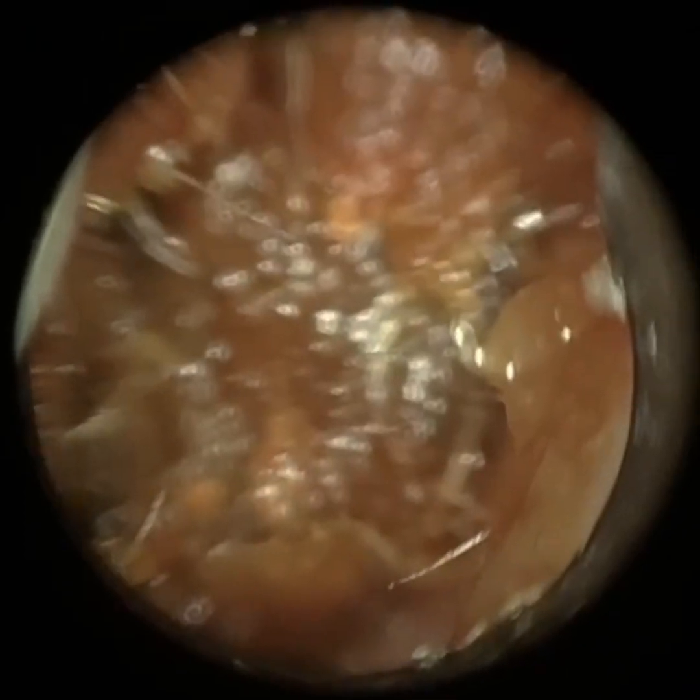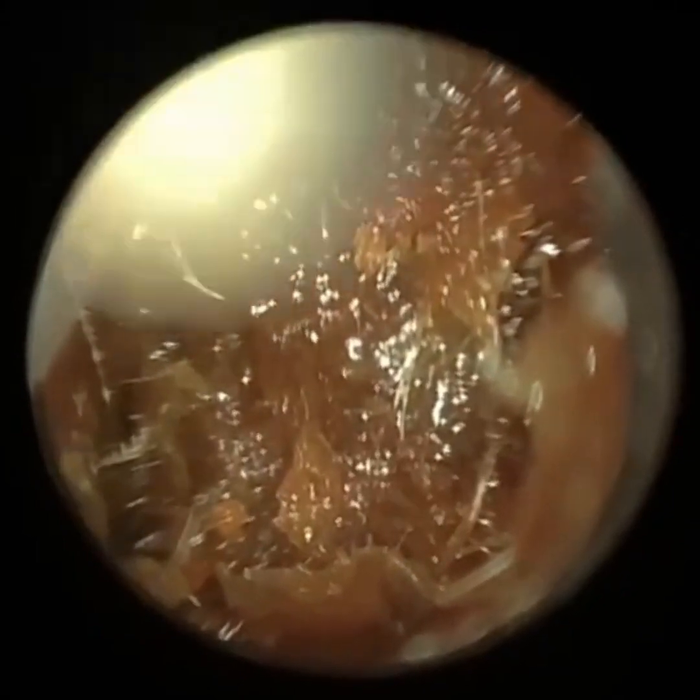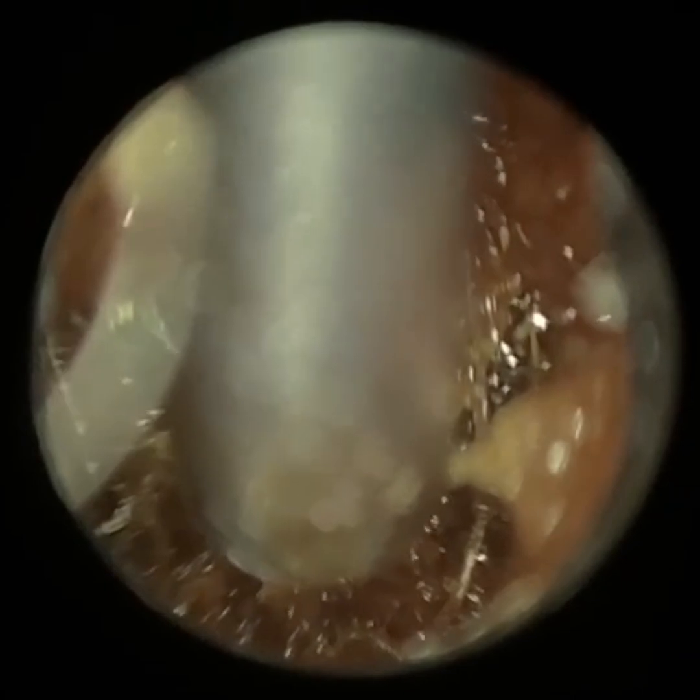Each time I watch him perform a procedure, his technique and skill level is definitely improving incredibly. This is a case that I asked Max if it was okay for me to share and upload because it just shows you what's possible with the Waxscope. It's a patient who attended with quite soft wax, and I think Max is using the Fine End Suction Probe here.